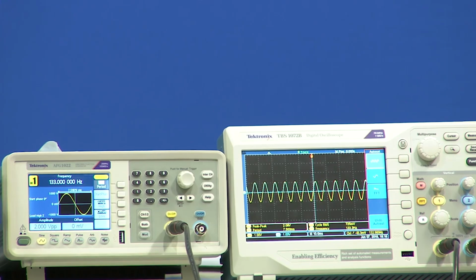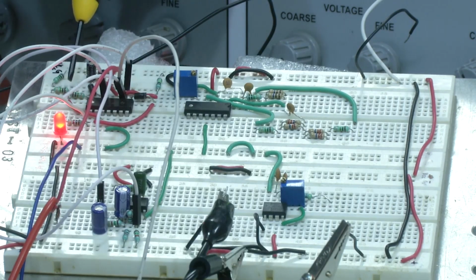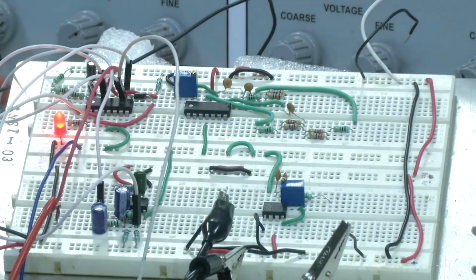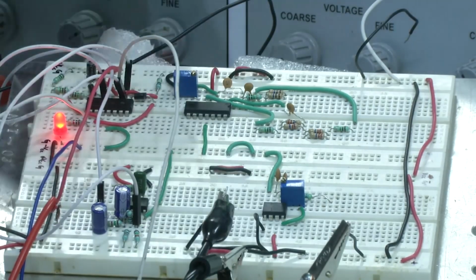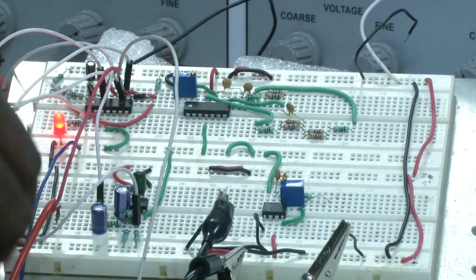In order to find the peak, if you remember, we are using a capacitor. Now, if you see here, when we look into the other part of the operational amplifiers on the board, we are using a capacitor and resistors of 1 mega and 2 mega, right. This particular combination will give us the peak detection as well as thresholding. Since we have already connected to this terminal, the output of this is connected to the next portion of our circuit, which is the peak detection. It is already connected using the white color wire here, the output of this, and now what I will do is take the output to the CRO.